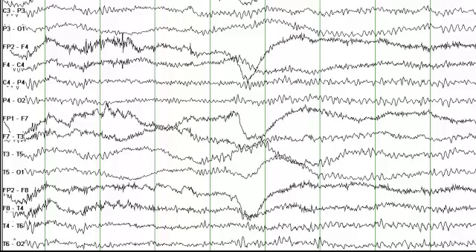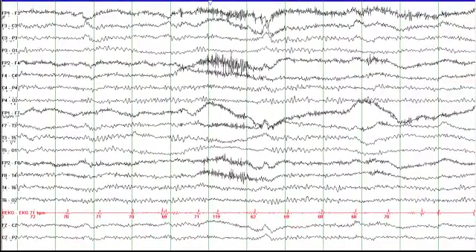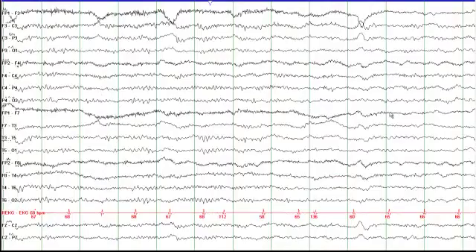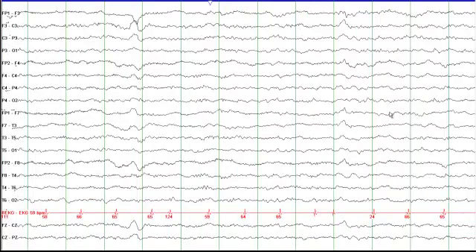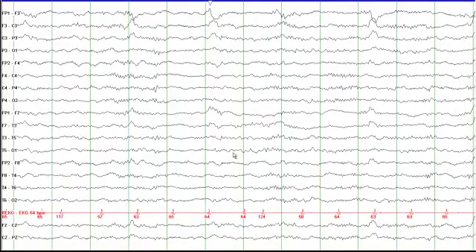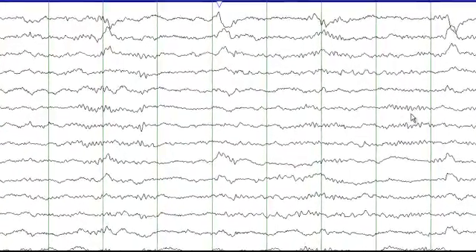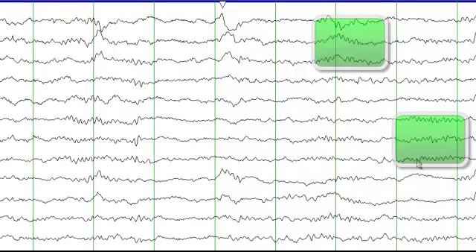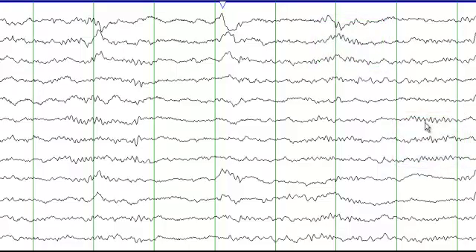There is muscle artifact and beta activity in the frontal head regions. Within each of these epochs — a little more than 10 seconds — there is slowing on the background, and then we start seeing some periodic broad sharp waves in the left frontal region. At this point you are seeing sleep spindles — not completely synchronized, but this qualifies for stage 2 sleep.